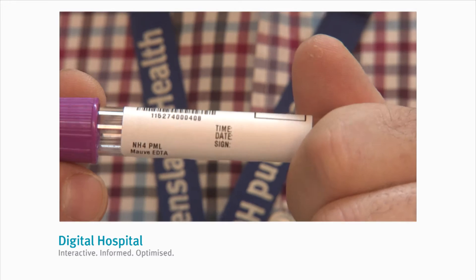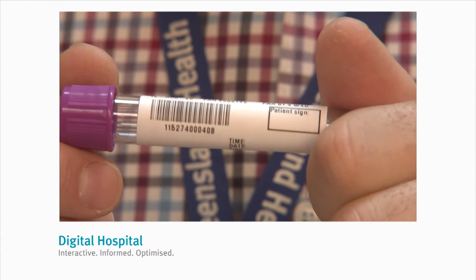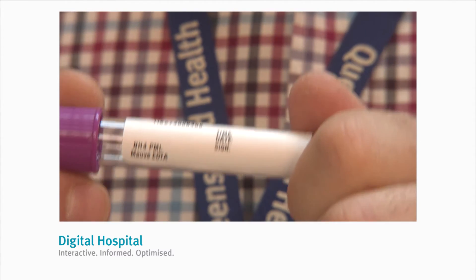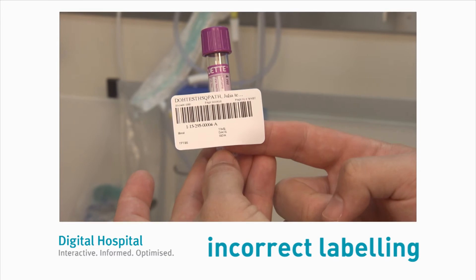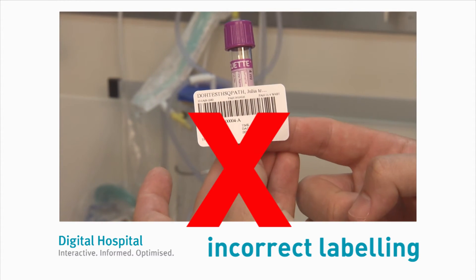So why is labelling so important? Cerner Millennium allocates a unique tube identifier to each tube rather than a single lab number to the entire collection. It's important that the correct label is applied to the correct tube to ensure it's processed correctly once received in the laboratory. The analysers in the laboratory expect a specific container ID for a specific test, and will not recognise an incorrectly labelled tube and will not be able to perform the test.